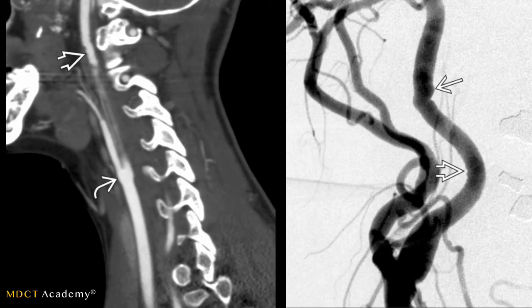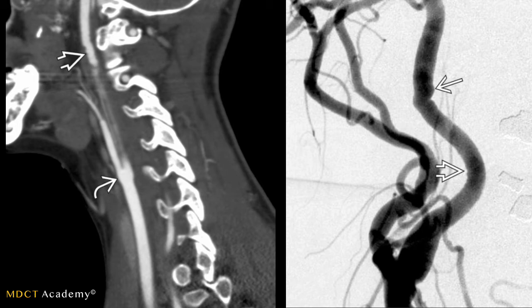Here is another case of type 1 fibromuscular dysplasia, seen higher up with the open arrowhead showing the compressed bead-like appearance, which is smaller and more subtle. When a DSA was performed, as seen in the image to the right, the finding is demonstrated much more clearly.